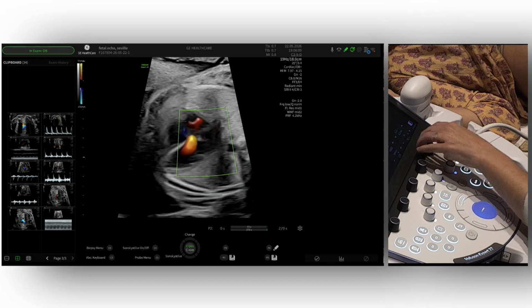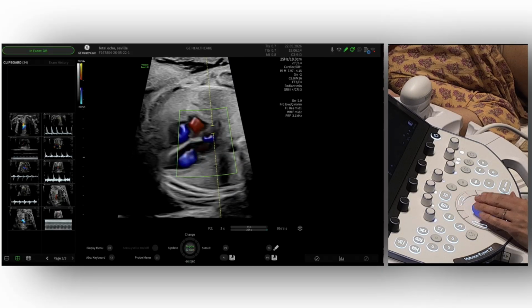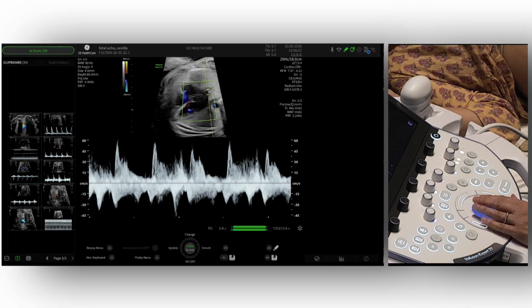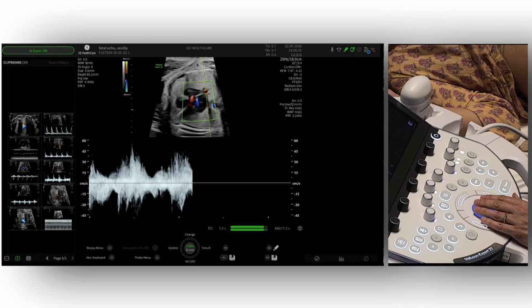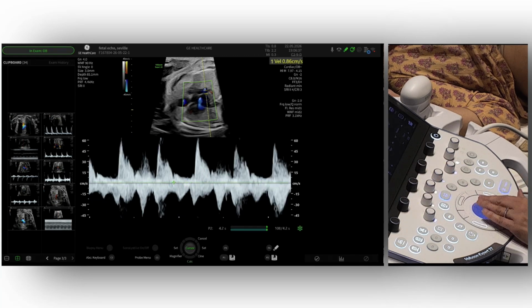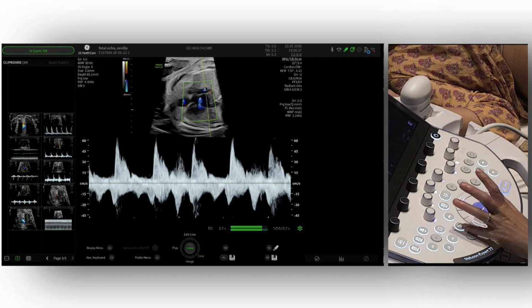We will go down a little bit there. Yeah, so imagine that you want to insonate the pulmonary veins. Do not breathe, no respires ahora, un momento. Okay. And then even if we don't want to, many times we get at the same time the vein and the, no respires ahora? Okay. Because this is very close to the diaphragm. Okay, now. Better. It's moving a bit, but okay.